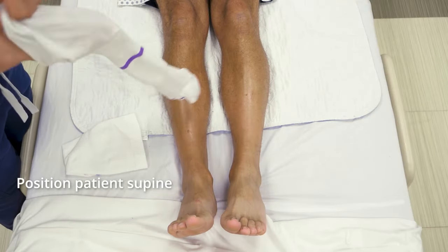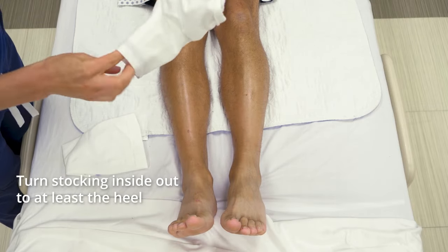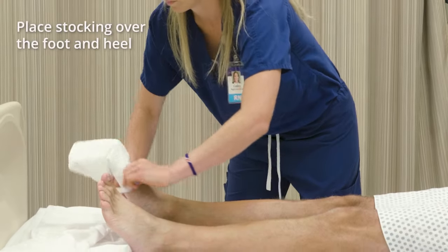Position the client supine, lying face up in bed. Turn the stocking inside out, at least to the heel. Place the foot of the stocking over the client's toes, foot, and heel.